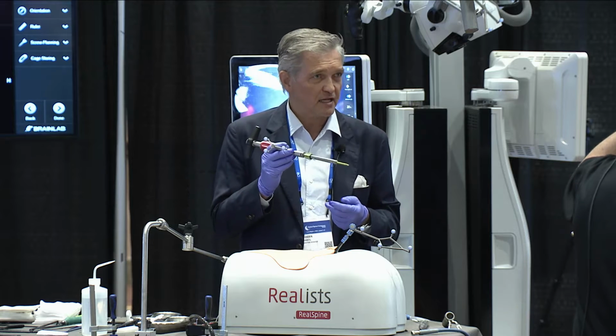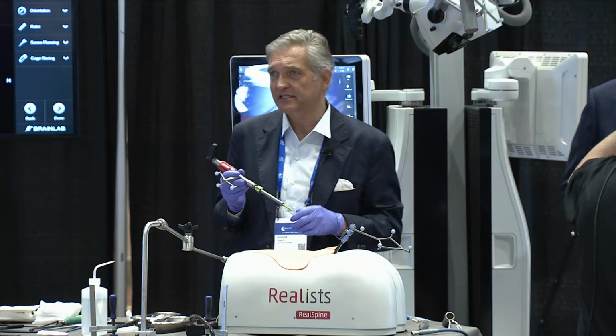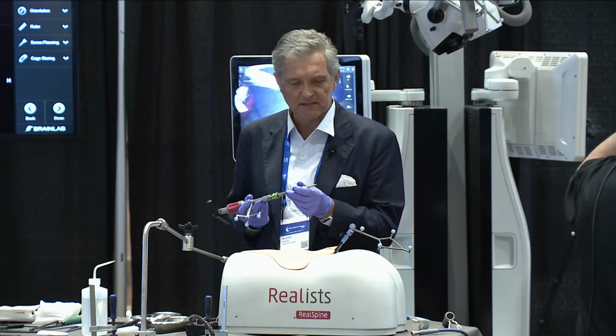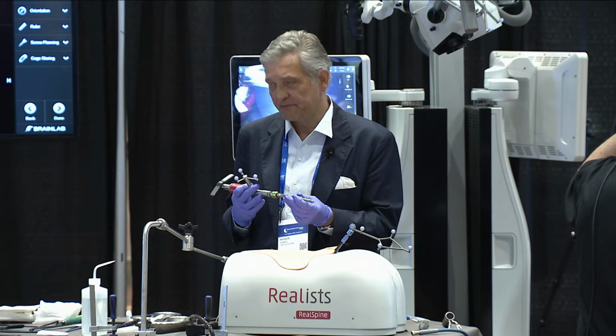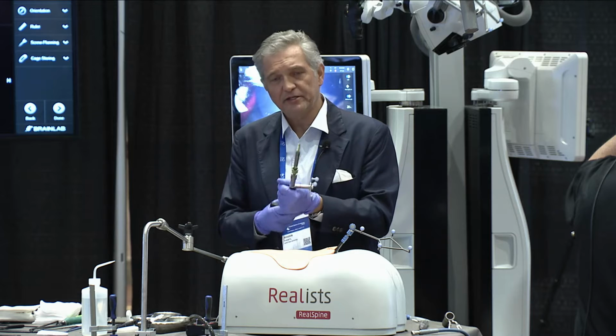But did we calibrate that already? Yeah, so we calibrated it. There's an instrument that you use to calibrate it, and then you can put all your pedicle screws with the single pass Viper Prime pedicle screw. Okay, so now I know the size.